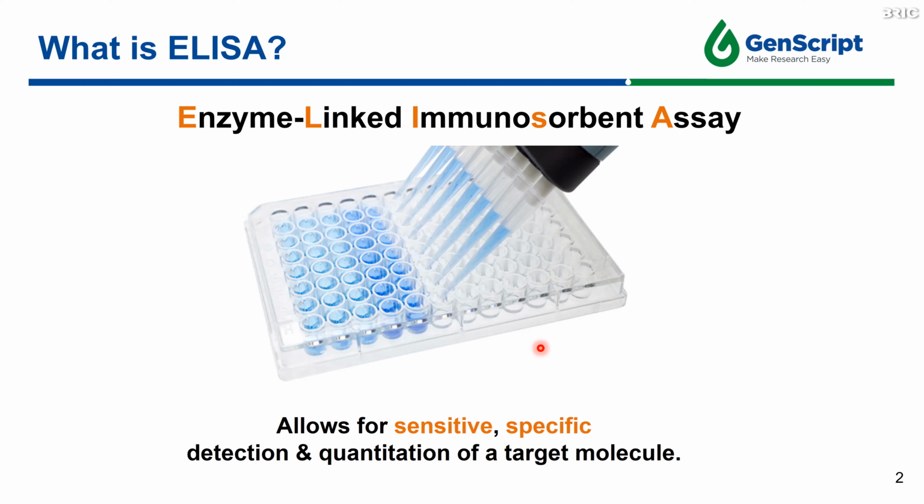It is not only used to detect the presence or absence of target molecules in complex biological solutions, but also often used to validate the specificity of an antibody towards a specific antigen. It is widely used across a broad range of industries, such as diagnostic tools in medicine, quality control in the food industry, or validation tools in basic research.